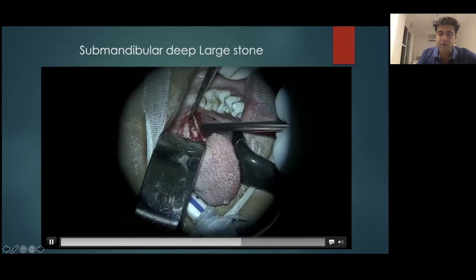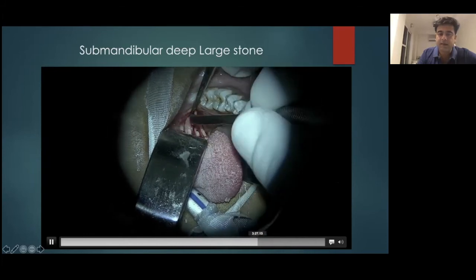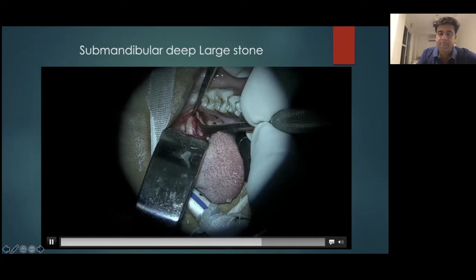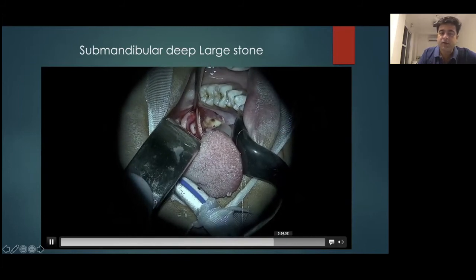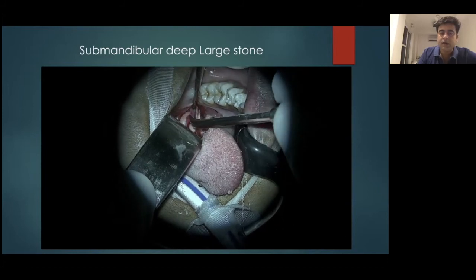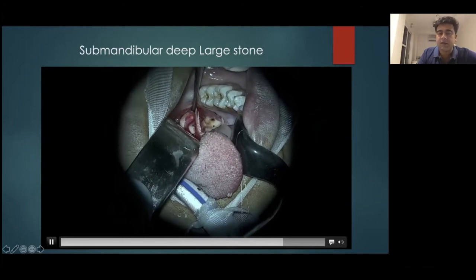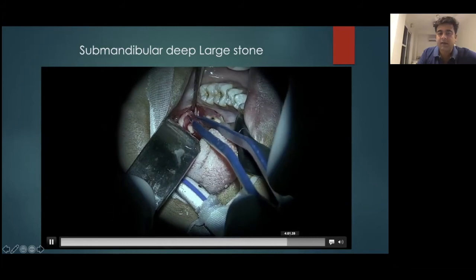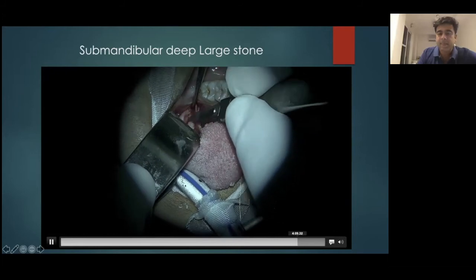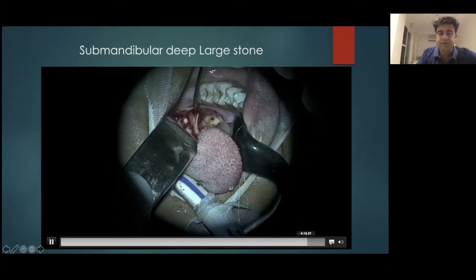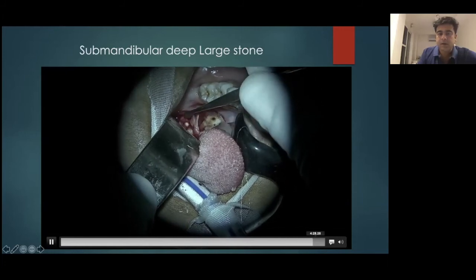After isolating the duct — visible right in the centre of the screen — you can put in an endoscope to localize where the stone is. In this case it was freely palpable once the dissection was done, though it really was not palpable before. A slight cauterization just over the duct reduces the amount of bleed, then with a sharp knife you just give a nick, and there's your stone — really, really deep inside. Voila.